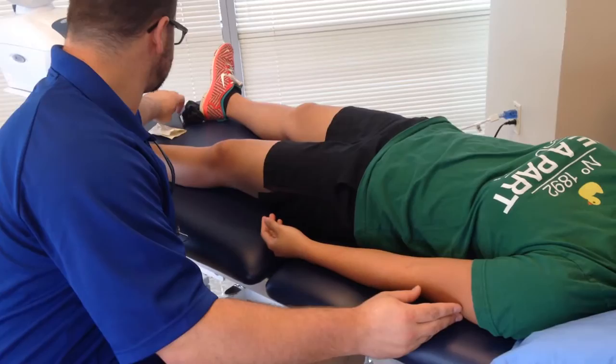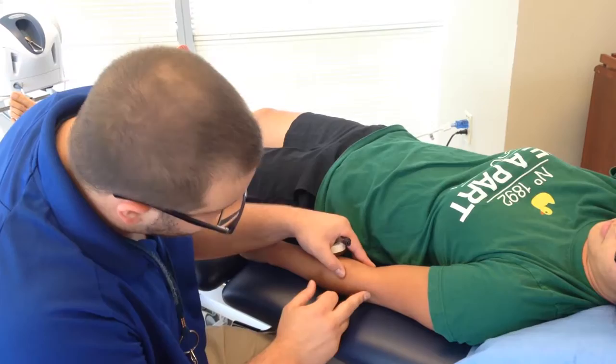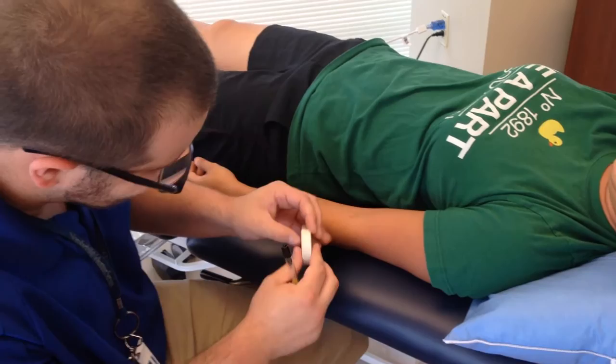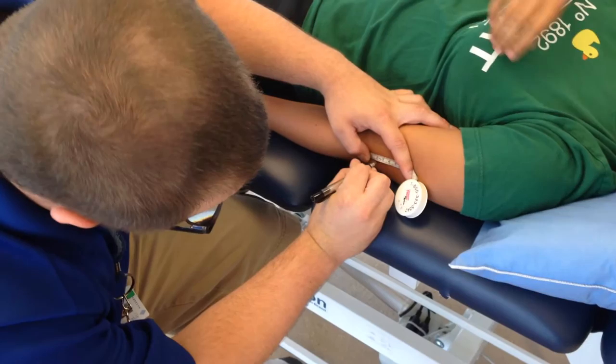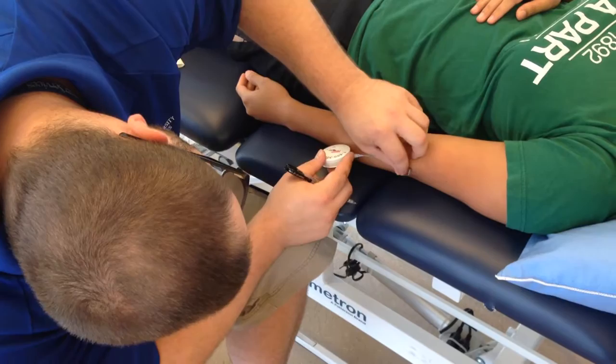For the elbow, we're going to just relax. Same thing — you want to find your bony landmark. I personally am going to use the lateral epicondyle of the humerus. I'm going to mark that. And then for her as well, we're going to go three measurements proximal and three measurements distal in two centimeter increments. It's always easier to go ahead and mark your landmarks — three proximal and three distal.